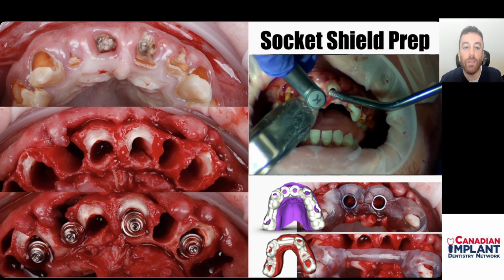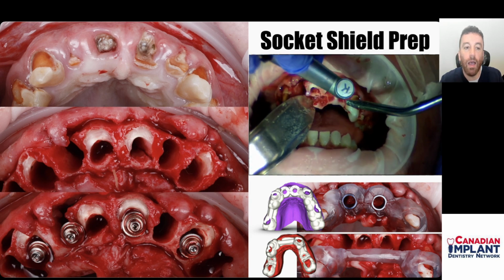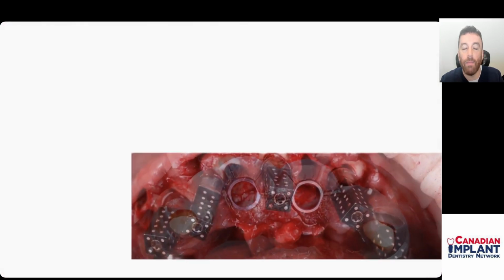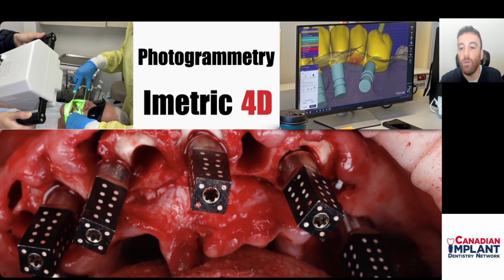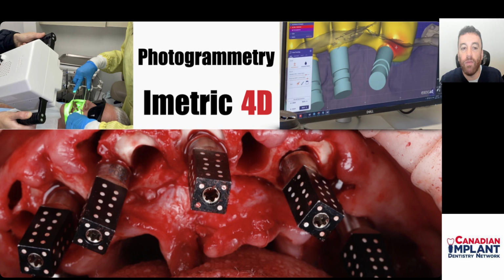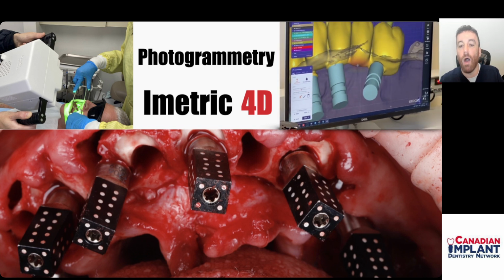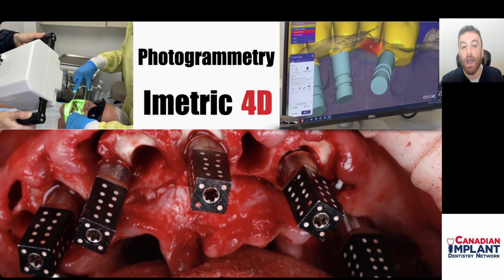Now, if the implants are stable enough, on the day of the surgery, we end up doing a pickup. So what we use in our practice now is photogrammetry. So we use the iMetric 4D system for the last 5 years with amazing success. Why? It allows me to have a same-day temporization with high accuracy.